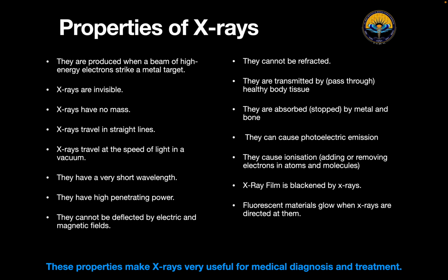The only point which I want to cover here is that X-rays will cause blackening of the film. It should be kept in mind that whenever X-rays interact with the film, they will cause blackening of the film, and wherever X-rays cannot reach, that part of the film will remain white.